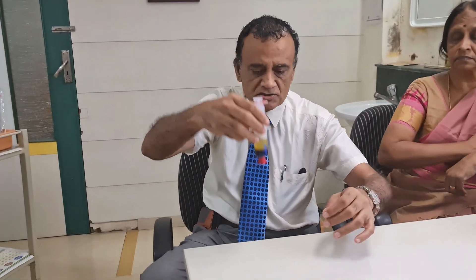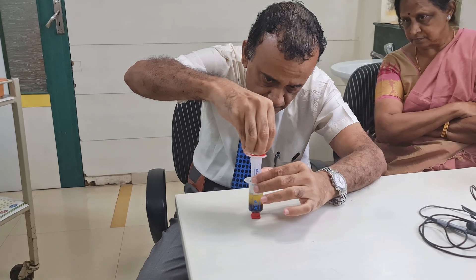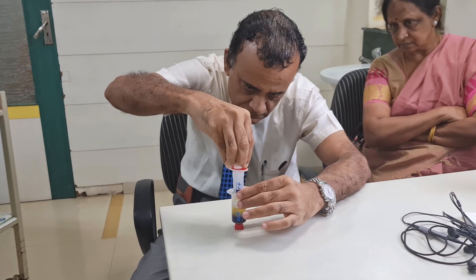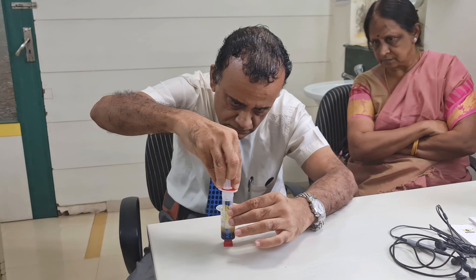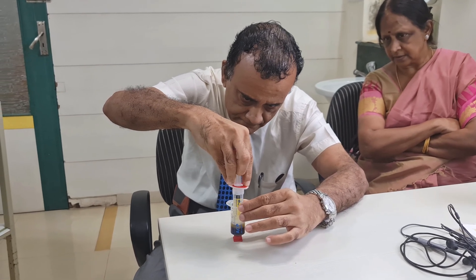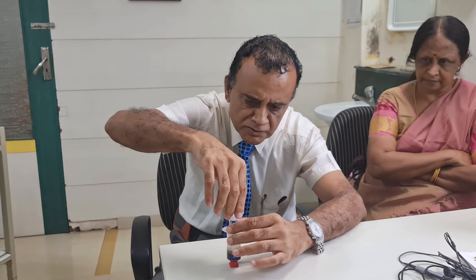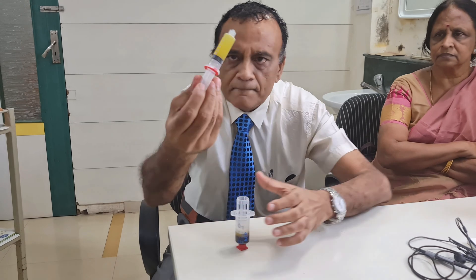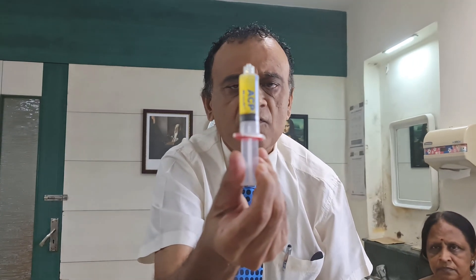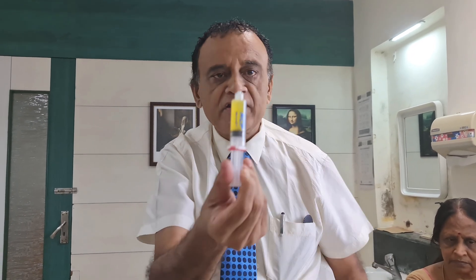We will do it from the second syringe as well — again, clear PRP. I am going to aspirate the supernatant fluid into the inner syringe. 6 ml of PRP. Turn the inner syringe anti-clockwise. 6 ml of platelet-rich plasma. Two syringes have got it. We put a cap on it and it can wait — it will stay like this for half an hour without clotting.